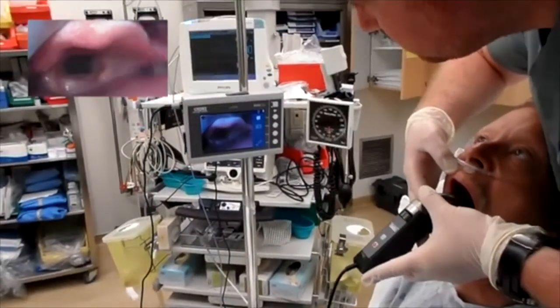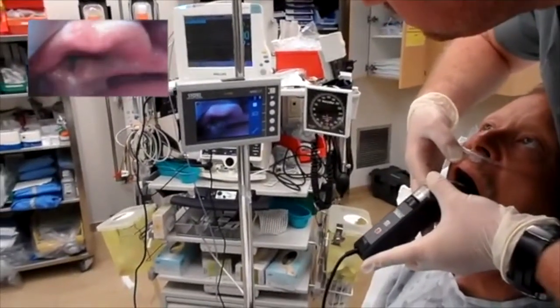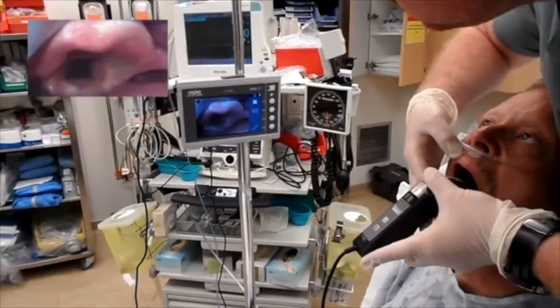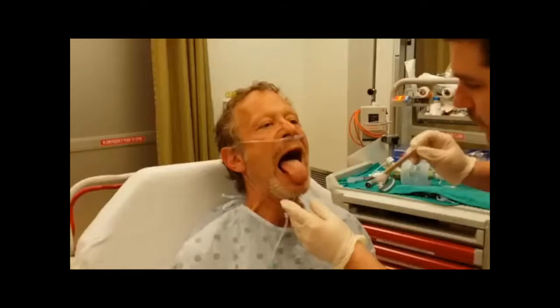This technique of precision laryngoscopy or no-touch laryngoscopy is useful for other things as well. So for example, a neurocritical intubation where you don't want the sympathetic surge that's caused by laryngoscopy. If you can limit stimulation during laryngoscopy, you're going to get less surge. So doing this sort of technique during a neurocritical intubation, let's say a dissection or a subarachnoid haemorrhage, makes sense.